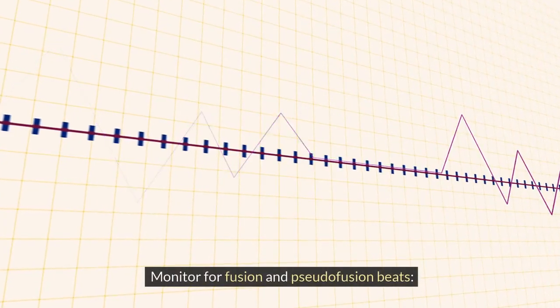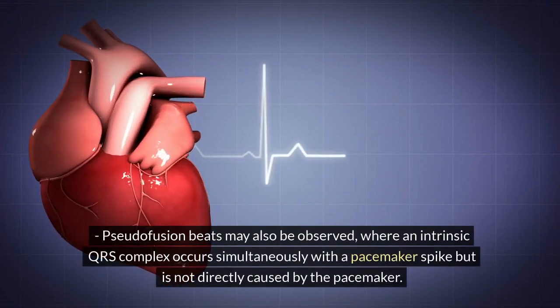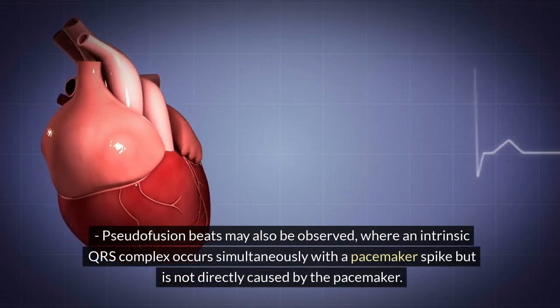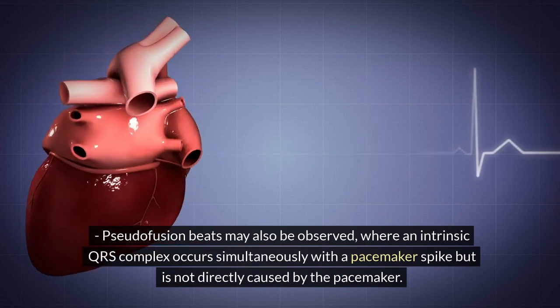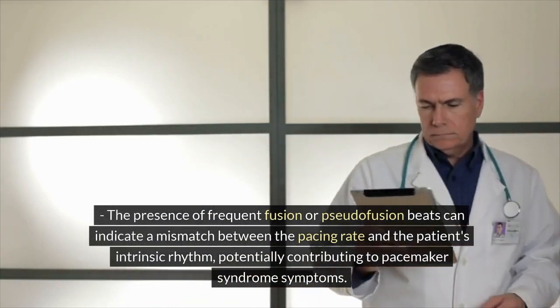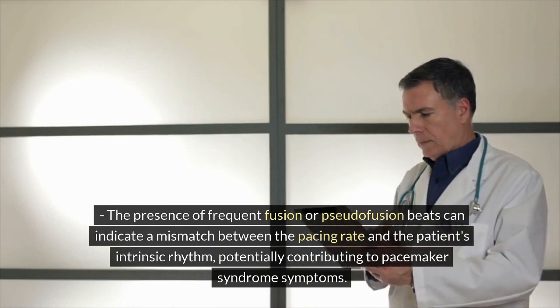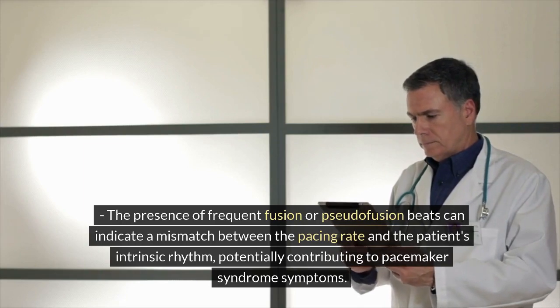Monitor for fusion and pseudofusion beats. Look for the presence of fusion beats, which occur when a paced ventricular beat coincides with an intrinsic ventricular depolarization, resulting in a hybrid QRS complex. Pseudofusion beats may also be observed, where an intrinsic QRS complex occurs simultaneously with a pacemaker spike but is not directly caused by the pacemaker. The presence of frequent fusion or pseudofusion beats can indicate a mismatch between the pacing rate and the patient's intrinsic rhythm, potentially contributing to pacemaker syndrome symptoms.